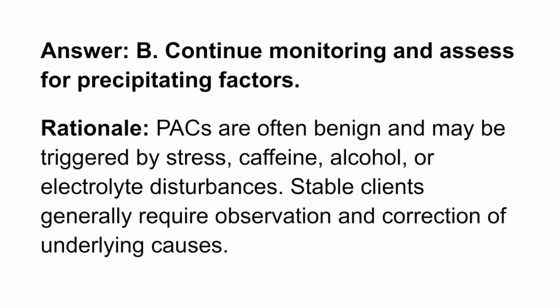Rationale. PACs are often benign and may be triggered by stress, caffeine, alcohol, or electrolyte disturbances. Stable clients generally require observation and correction of underlying causes.